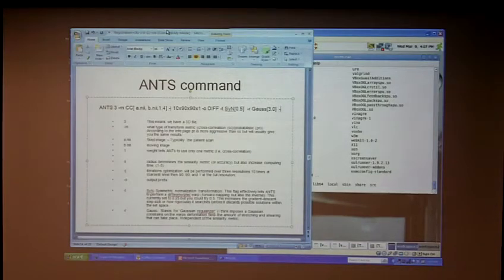Usually, for the most part, that turns out to be the output where we quantize the values to make sure that it's 1s or 0s. But yeah, usually at the end. That's a step that we'll come to. That doesn't matter for 3+. As far as I've known, it hasn't affected any of the lesions that I've fed to the script.